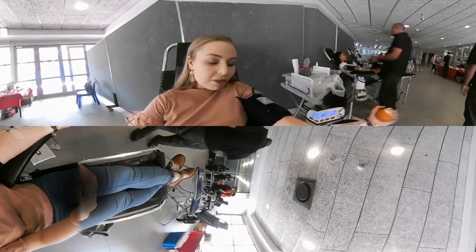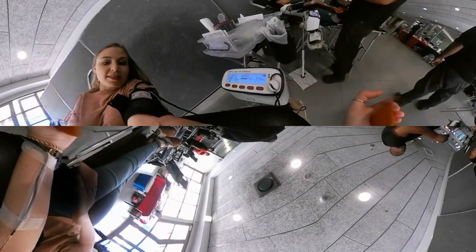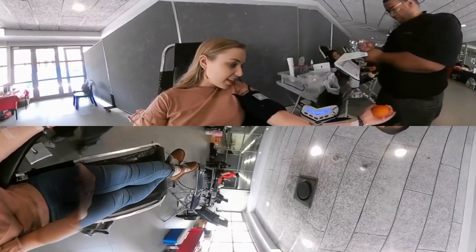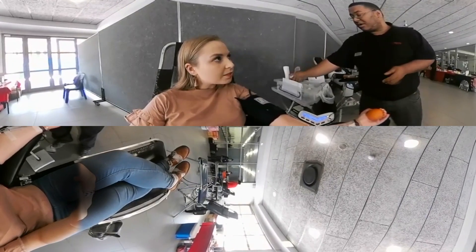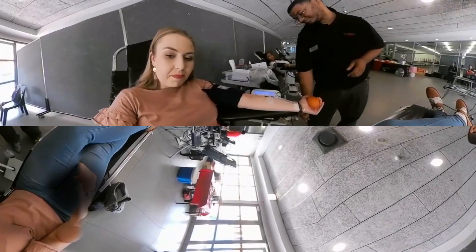I'm on 705 grams at the moment — let's get a close-up of that. I'm finished! I've donated — that's 784 grams, which is 450 millilitres. Wasn't so bad.